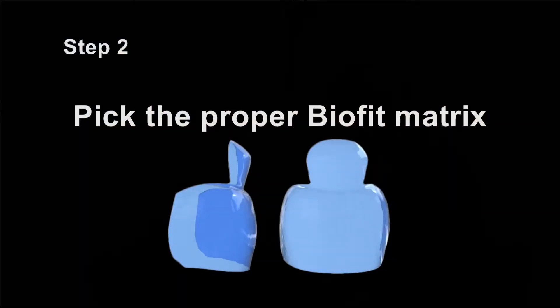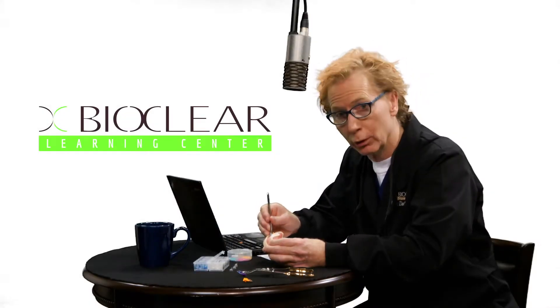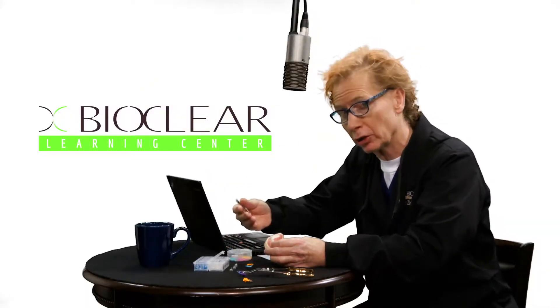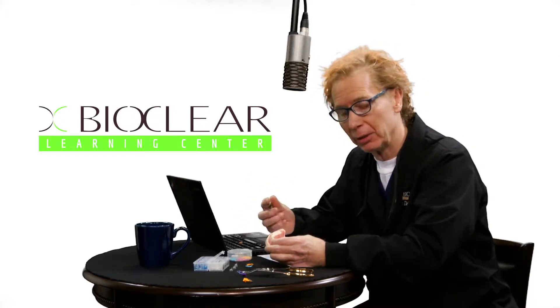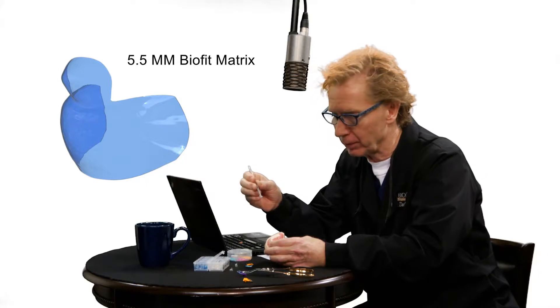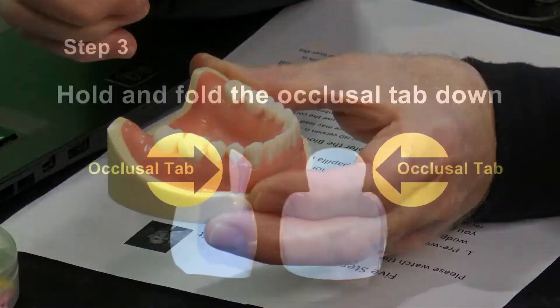Here is a clinical photograph demonstrating pre-wedging in a case where I am about to retreat a quadrant of failed amalgams and composites. Step two: pick the appropriate BioFit matrix. Once you've cut your cavity preparation, you're going to remove the pre-wedge. You'll either be able to reuse that pre-wedge, or sometimes you can do progressive wedging and move up to a larger size because you've compressed the papilla and begun to push the teeth apart. The most commonly used BioFit posterior matrix is the 5.5 millimeter matrix. Make sure to slide this in with a little bit of a tilt because it will nestle nicely under the tooth.